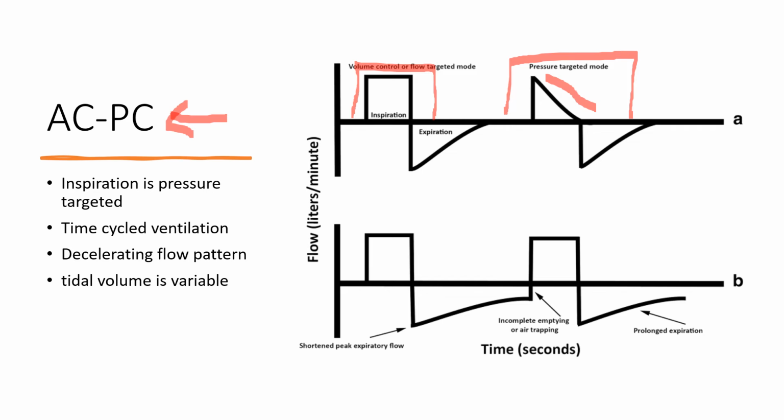So that is the big difference between both. And I just wanted to show you, just for FYI, this is flow, right? And you see how this area right under here, that is known as air trapping. What happens is the new breath is being delivered right here without the patient fully exhaling. And we'll get a little bit more into that.